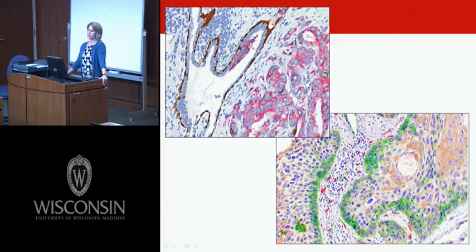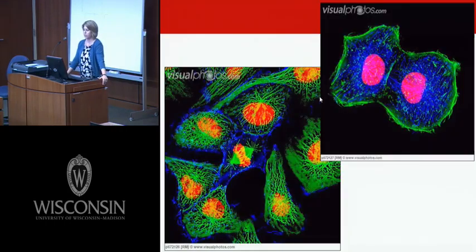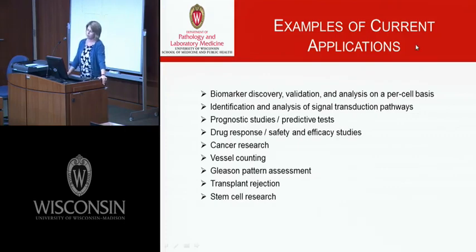So here we have a tissue fragment, and we can see that in this particular image, there is a brown stain and a red stain. For those of you that are performing prostate cancer research, this image is probably something that you've seen quite often. Additionally, here is a multiplex image that shows at least 3 different marker types stained in one tissue section. For those investigators that do immunofluorescence, this is just a nice image for you to see that you can have membranous staining, cytoplasmic staining, and nuclear staining all within one image.